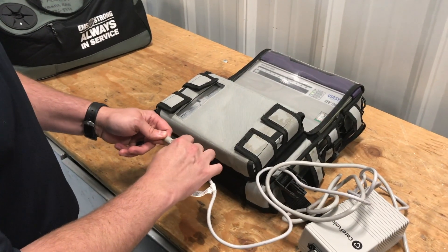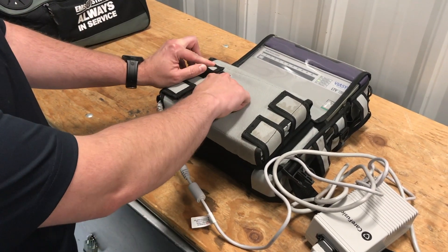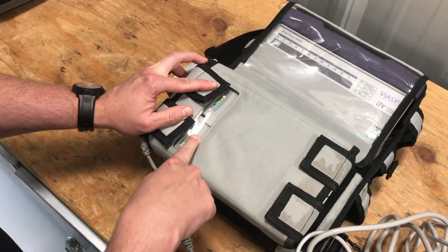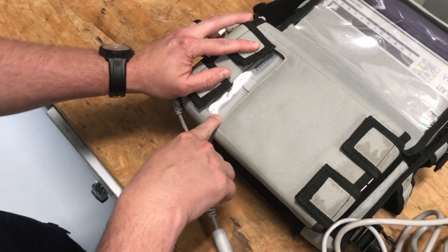Once we make the connection and hear it click, we'll see the batteries light up. We'll have an amber light and then they'll go green. These batteries are all full so it lit all the way up on both battery packs.